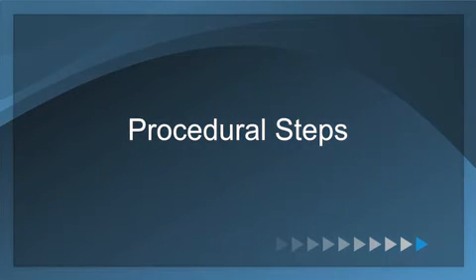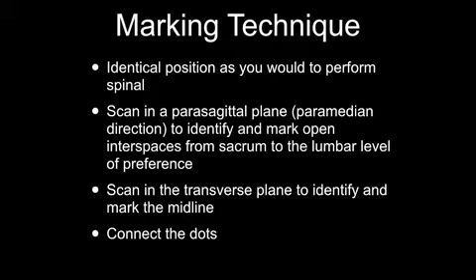Procedural steps. This technique is known as the marking technique. You will use an identical position as you would to perform a spinal or epidural.